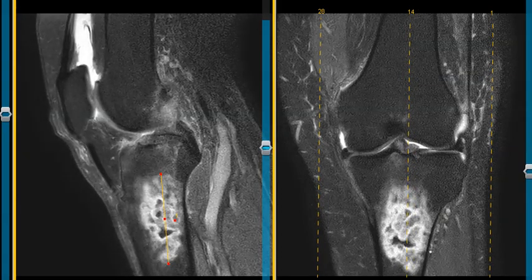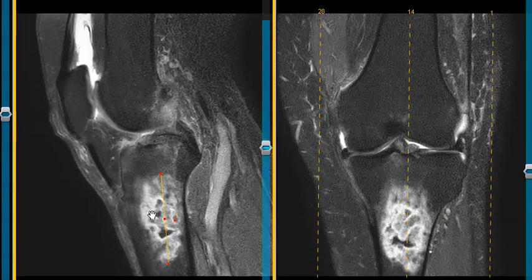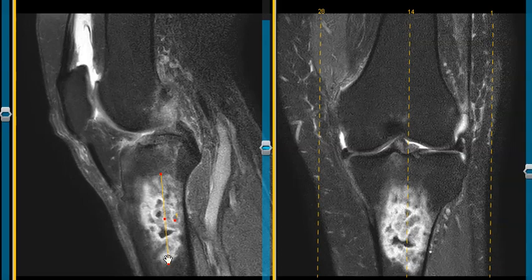We believe this is just a bone infarction where it has lost the blood supply and the bone is starting to die and become necrotic. With these lesions, we start to see sharply defined serpiginous margins, and eventually the edema will go away and we'll be left with a bone lesion that has sharply defined low signal intensity margins around the rim on certain sequences.